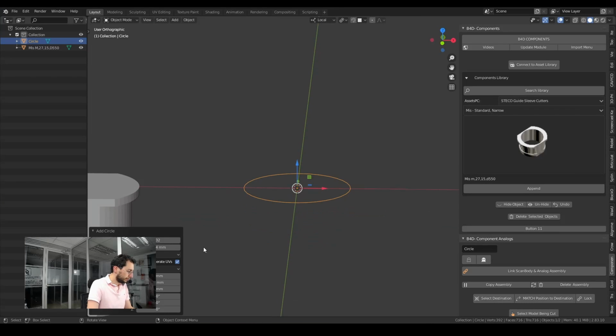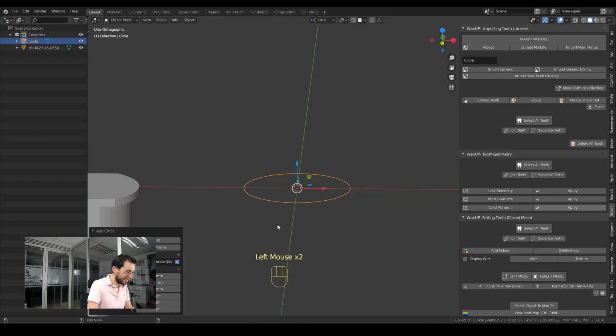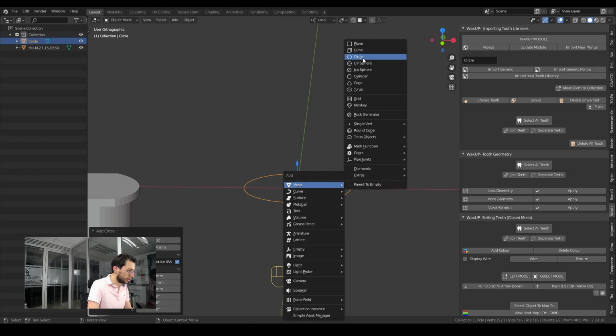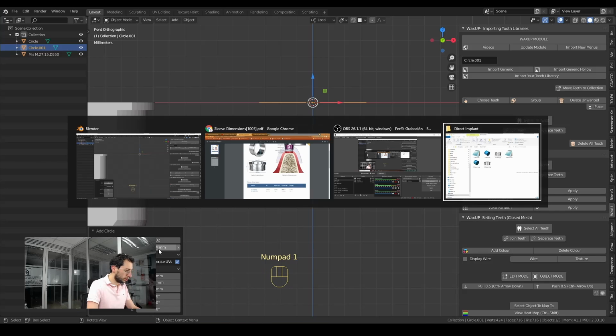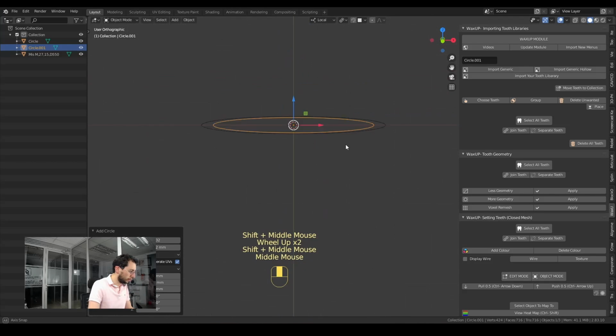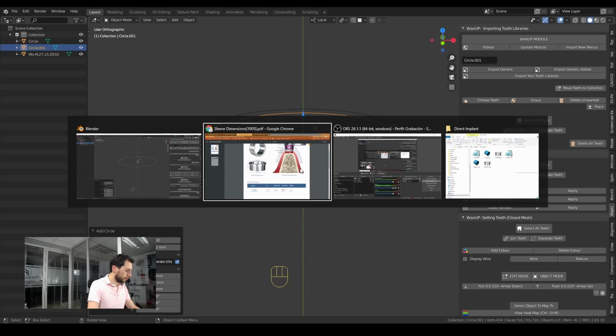5.84. So the same thing, I can use a shortcut, which I will show you here. And to add the circle, I press Shift and A, and I get this menu where I can choose circle. Okay, so now the size was 5.84. So I type here 5.84 divided by 2. Okay. And now I have the lower dimension.